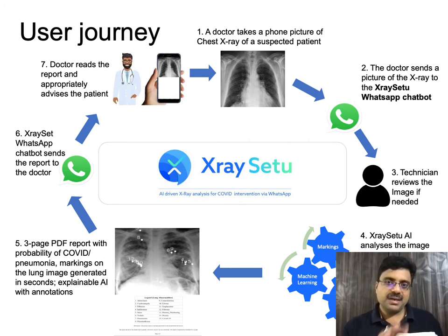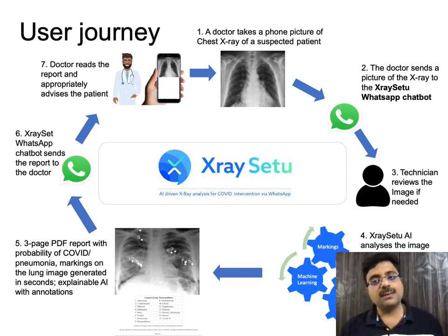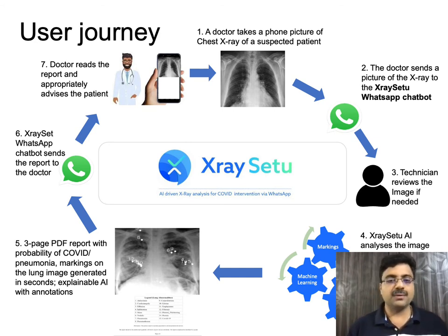This WhatsApp-based distribution with no need to integrate with existing hospital IT systems was extremely crucial in fast and widespread adoption of the service. It was also very useful in helping doctors and technicians take informed decisions on managing limited supplies of RT-PCR kits, medicines, etc. And for patients, it was a quick way of risk assessment and a real option to assess whether a further scan was merited, in the form of an expensive HRCT or maybe even an RT-PCR scan.